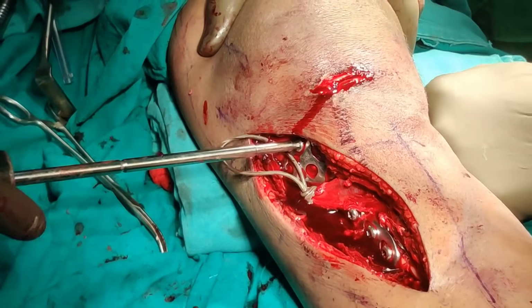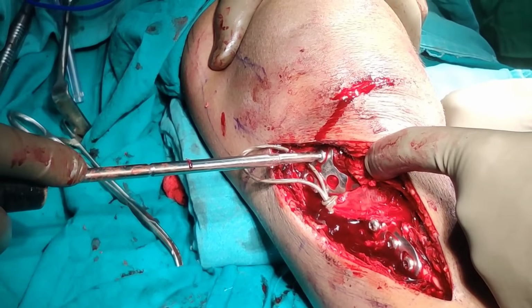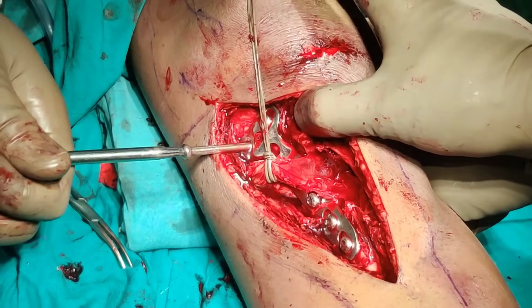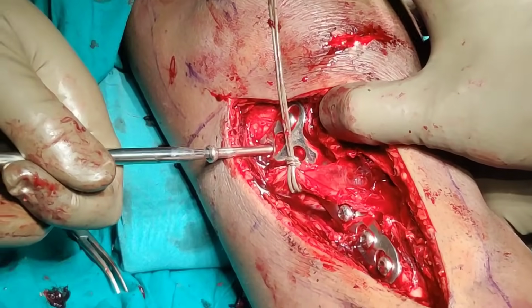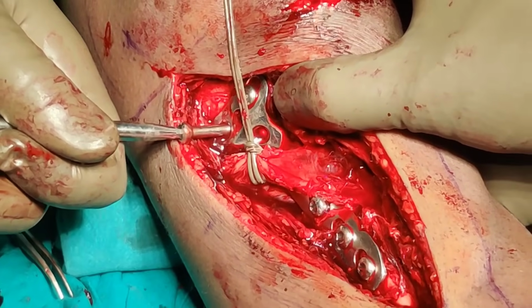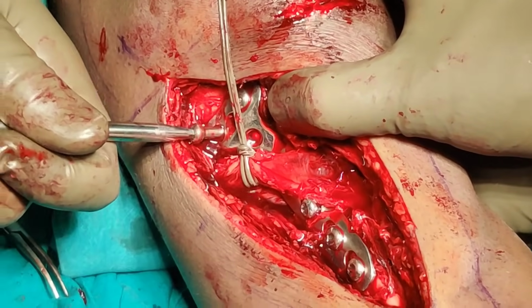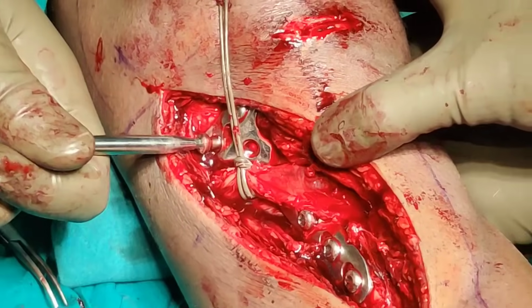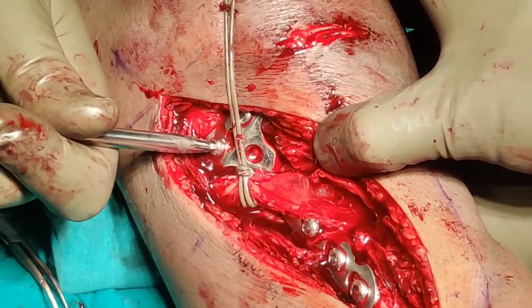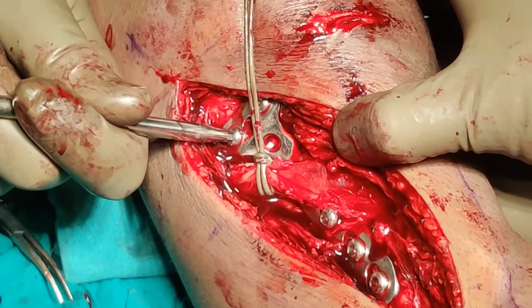So now we have used a partial threaded screw, and it's a really good bite. So now we are putting the second screw through the T plate. When you are using the plate in buttress mode, you don't really need these screws, but because it's an intra-articular fracture, we're just trying to compress it and gain some more compression if possible. Otherwise you don't have to necessarily fill it, but we are going to do a good compression here with these 2 screws, and then I will show you how it looks.